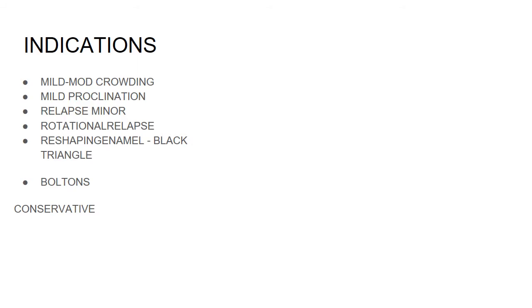So when do you advise IPR? We can advise IPR to increase retention after orthodontic treatment and decrease relapse. Yes. But this is not the commonest indication in orthodontics. The commonest indication is creation of space to carry out orthodontic correction. Say it's a mild crowding case, or a very mild flared incisor case. In such cases, if the space required is not excessive, extraction would be too much space. Extraction will result in excess space, and closing that space will increase the duration of treatment. So, in such cases, we can instead go for IPR.